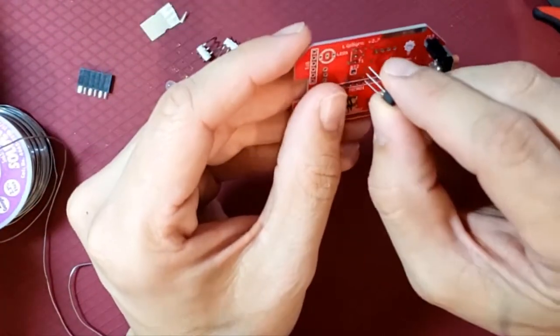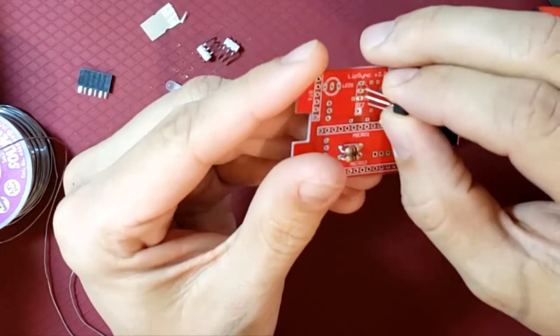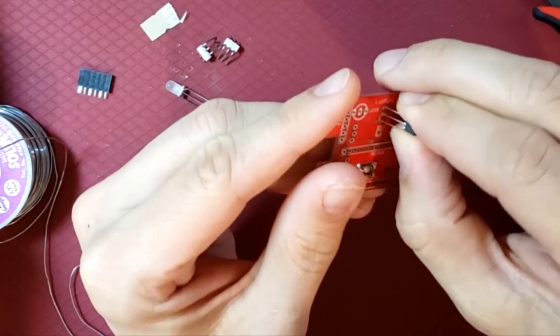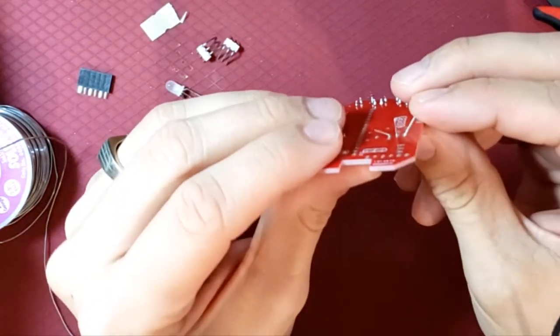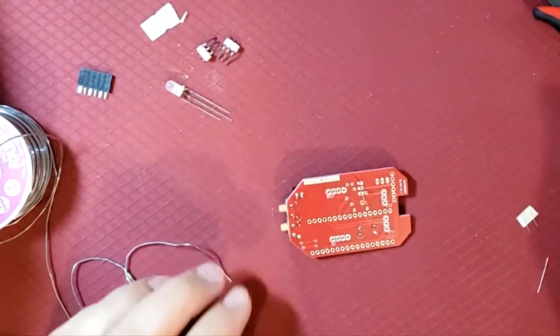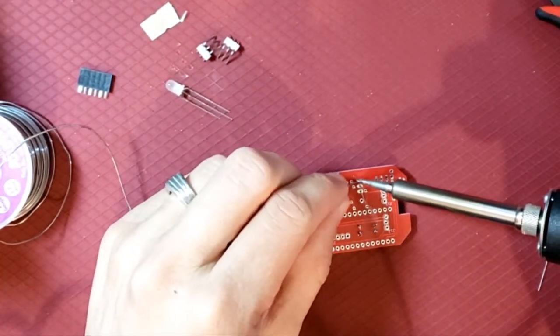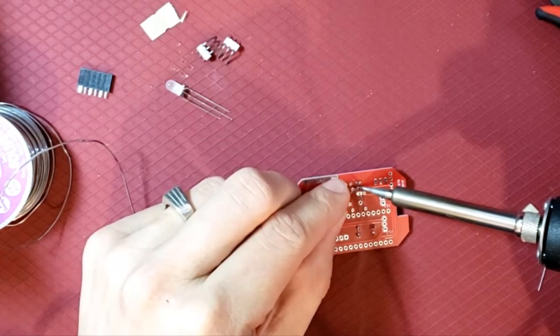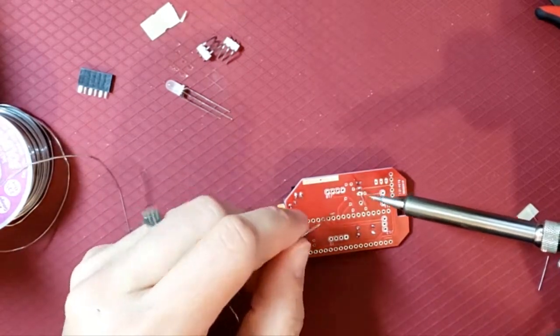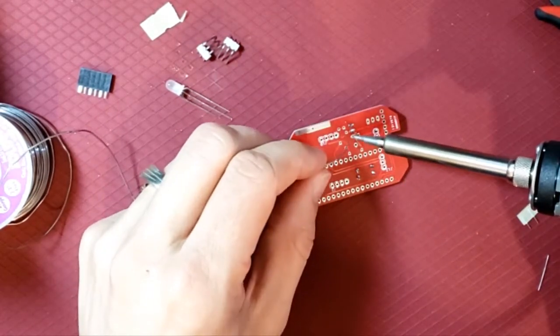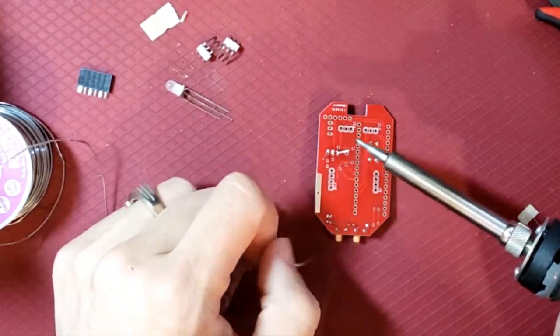This does matter which way it goes on the board. You can see this little white outline of the piece. I'll put this through. Bend those legs out a little bit to hold it in place and solder away.